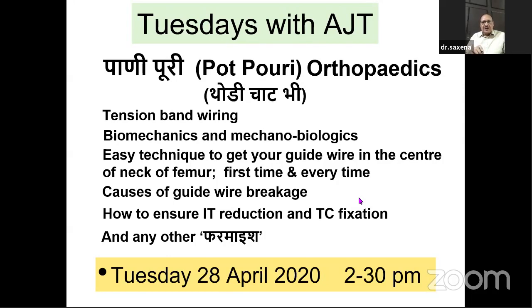Now, not only that distraction and compression lead to better union, it also changes the electrical impulses at the site of healing. And that is very important for callus formation. At one time, electrical stimulation was being used to promote the callus. A 0.2 milliampere current used to be used. Dr. Satyanand worked on this in a very large manner. When tensile or distraction forces are applied, the electrical impulses at the site are different, and when compression is applied, the electrical impulses are different.